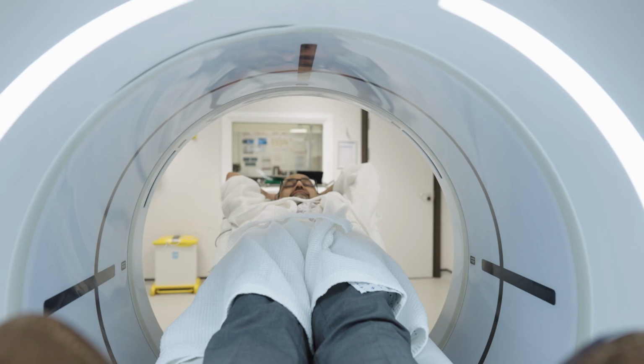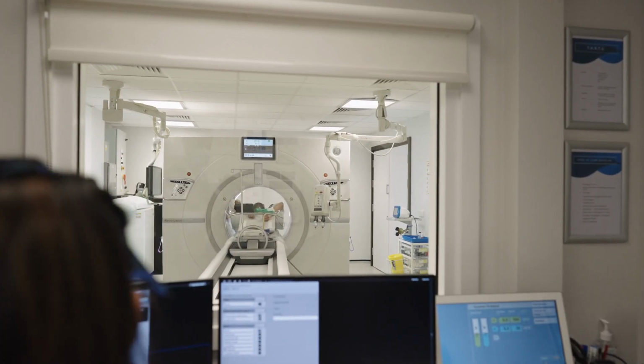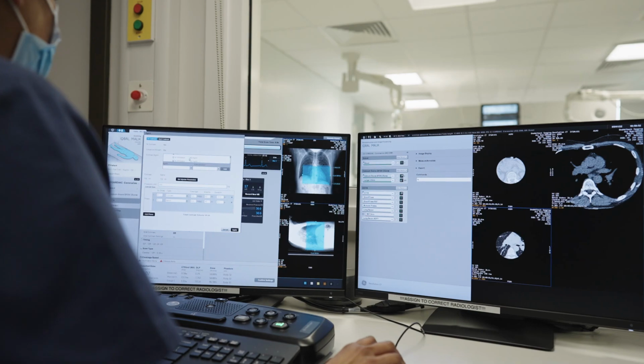And the other thing I noticed was that it was a little bit like being in the TARDIS. The CT scanner swirls around you, thankfully encased, and therefore you're not in any danger. But as it spins around, you get the flashing lights that you do when the TARDIS starts to take off or the tube starts to move through an underground station.